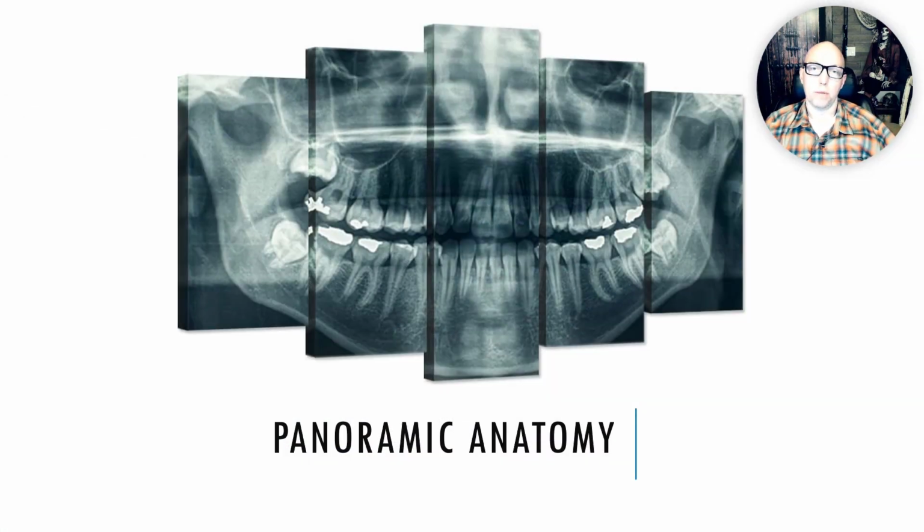All right, now let's get to our brief review of panoramic anatomy. Not going to go into too much detail. A lot of anatomy is just memorization, so you've got to spend the time going over the books. And I gave you links to the different chapters from different books. All of those chapters I think are great. They do a good job of panoramic and intraoral anatomy.